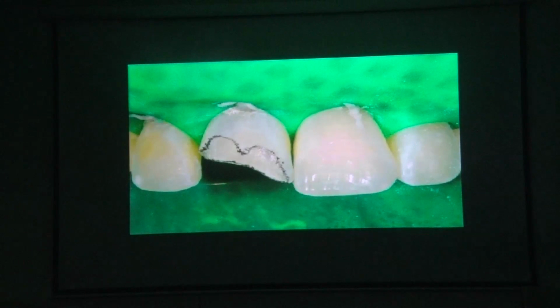Apart from this, when you etch, I have seen many people etching only till the bevel. One more trick: over-etch till here. When you etch till here, you remove even normal tooth structure, about 30 microns. Now you get a beautiful blend.